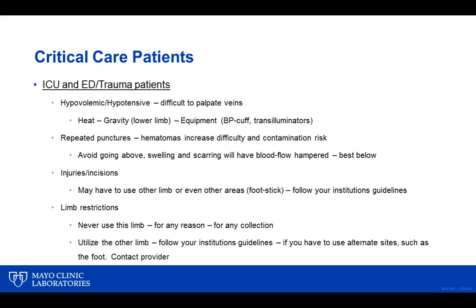And one of the suggestions was a foot stick, as Danny said, contact the provider prior to performing a foot stick. And I would suggest that when you do contact the provider, if they do give permission, to please ask them to document that. Please ask them to create an order, put it in the patient's medical file so that not only are we sure it's there, but any of our colleagues that may come later in the day to collect a specimen from that patient, it's there as well.